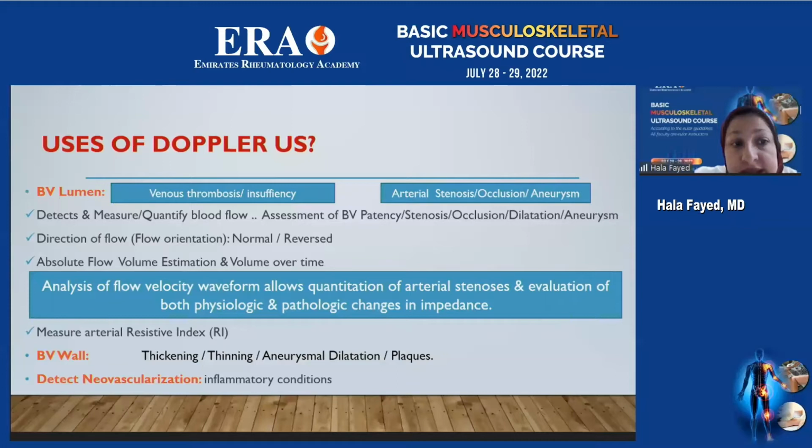It can detect, measure, and quantify blood flow, and assess patency. It can show the direction of flow, as we said, in the color Doppler, and it can show the absolute flow volume estimation and volume over time. As in spectral Doppler, it can moreover estimate what is called the arterial resistive index.